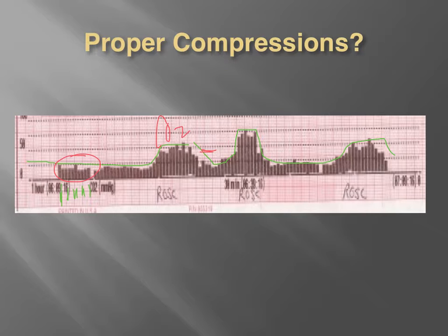So a little bit of a different scenario where a patient is truly hypercarbic, where they're off the charts with their carbon dioxide levels. But nevertheless, ROSC usually causes anywhere from a 10 to 20 point increase in carbon dioxide in the short term, and typically, like I said, that just levels out relatively quickly.